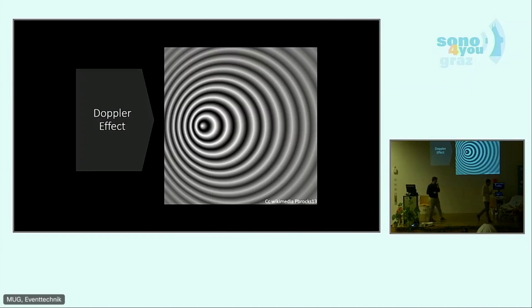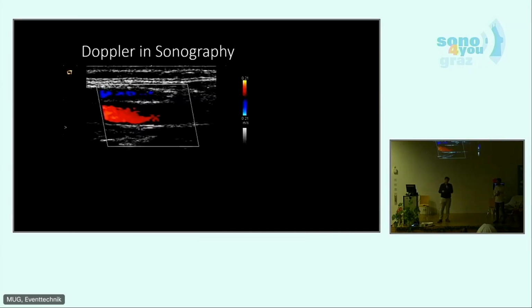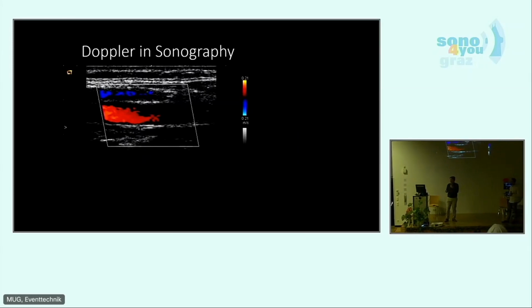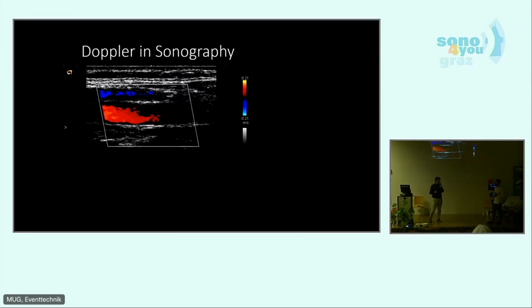Our next image technique is the Doppler effect. You all know the Doppler effect from an arriving ambulance, which has a high-pitched horn. When it passes you by, the horn pitches lower, right? You all know that. Our ultrasound machine also is capable of measuring the Doppler effect from passing erythrocytes, which is why through that technique, we do not see only the anatomic picture, but we can add the physiology. As you can see, we are scanning the vessels and we can visualize the flow inside of them. For example, for the carotid artery. So we would use rather the Doppler for the carotid artery than the M mode.